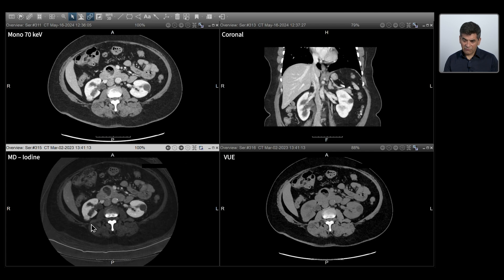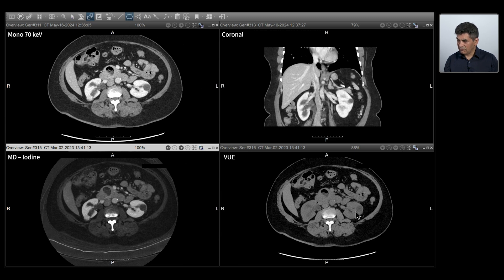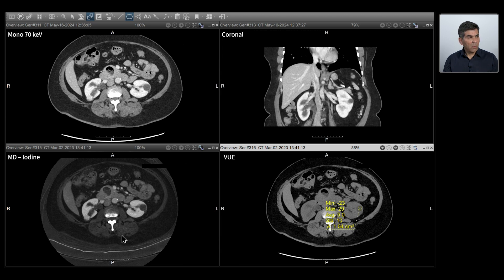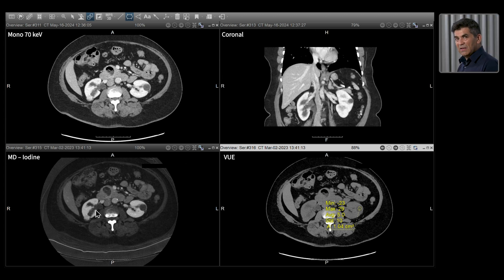Then we come down to the lesion in question in the right kidney posterior cortex. Compared to the lesion on the left side, this lesion clearly has a signal. We can compare this to the virtual unenhanced images, and that lesion tends to be much higher in signal compared to the virtual unenhanced. I can also get region of interest on these lesions to confirm this is an enhancing lesion and compare values. The attenuation values are pretty low on the virtual unenhanced, which tells me it's not suppressed — it's enhancing.